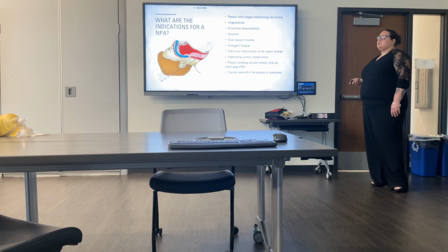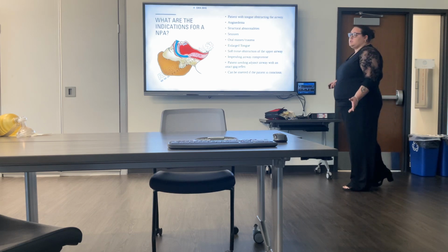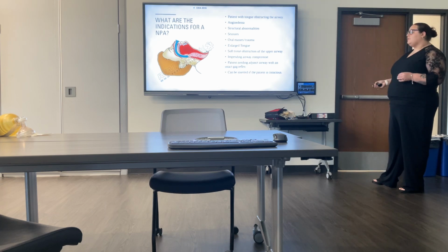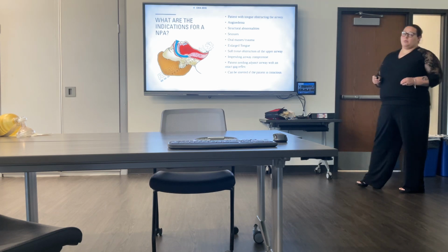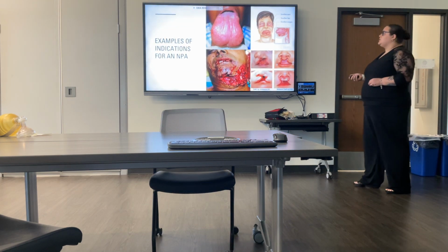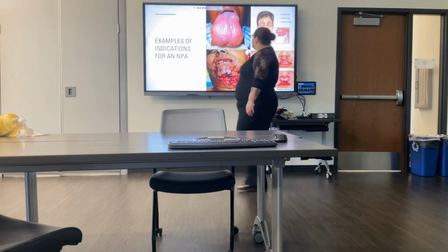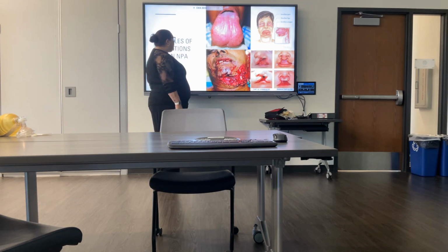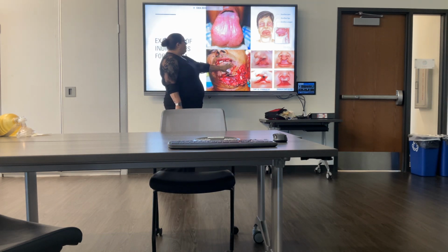And it can also be inserted whether your patient is conscious or unconscious. So the patient does not need to be unconscious for you to place an NPA. It is uncomfortable, but it is bearable for the patient. So some of your indications for an NPA, this is an example of your enlarged tongue, that macroglossia. This is an example of some oral trauma.